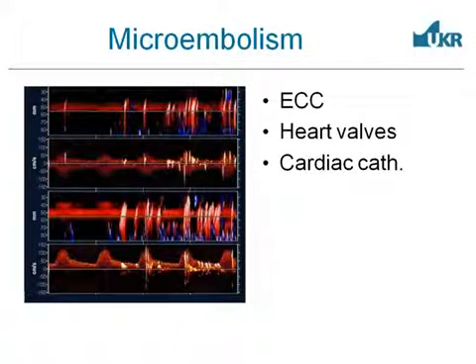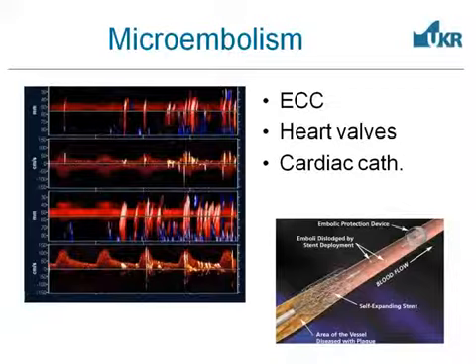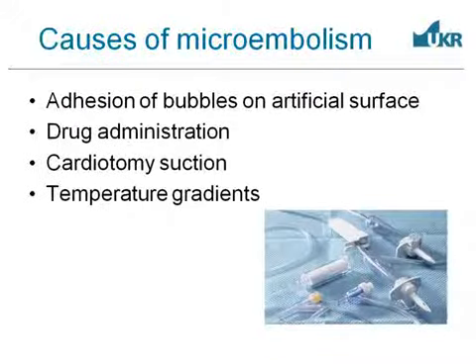This morning the microemboli have also been differentiated from the macroemboli, which we see in various settings, and it has also been told that microemboli are not only gaseous, but can also be solid particles. There are many ways to prevent solid particle dislodgement, and I won't go into detail with that. I will only be speaking about gaseous emboli. The causes for microembolism are, of course, manifold. You all know this. This is nothing new.